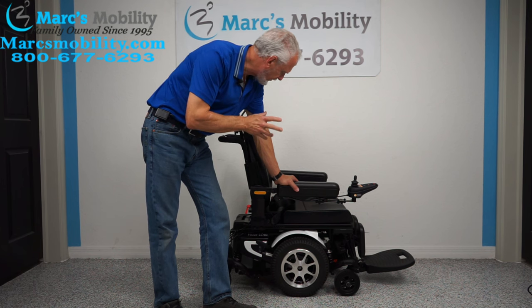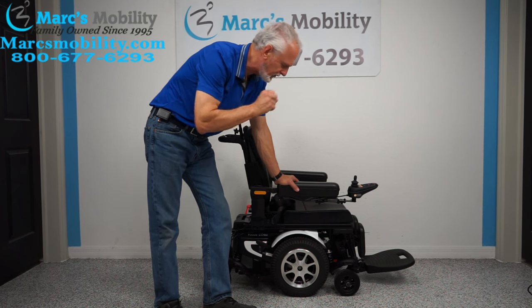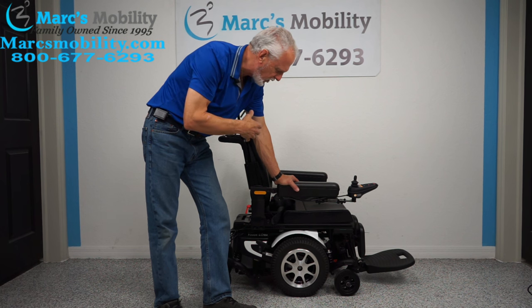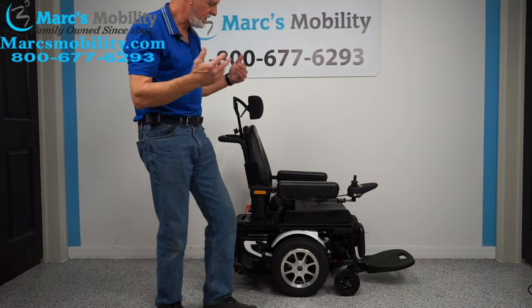Vision Ultra Power Chair by Merit's. This chair has the electric tilt and it has the electric feet — two electrical functions. There are a lot of other things on this chair that are different than most chairs, which we'll cover as we go along. The first thing we'll do is show you how to make the seat tilt.